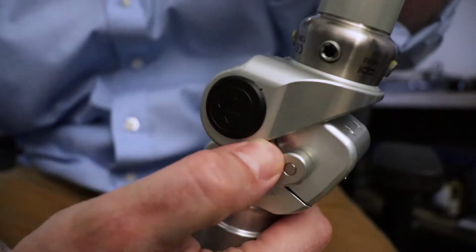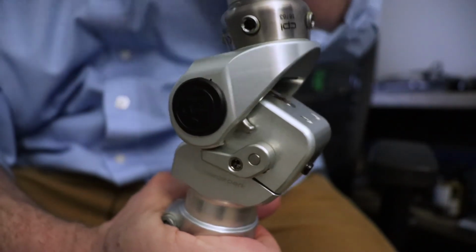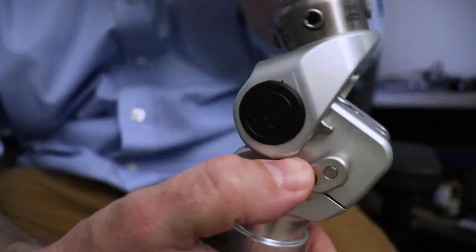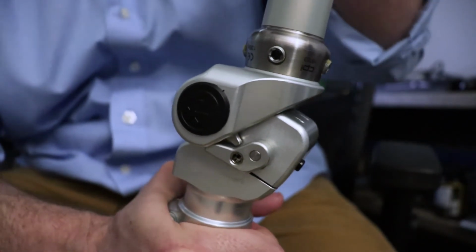A little bit of weight on the toe, and now the knee unlocks again. So you always want to check that stance flexion. If you don't have enough, it may be causing some problems with getting the knee to unlock or binding up.